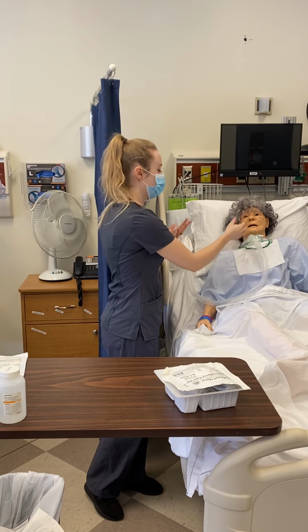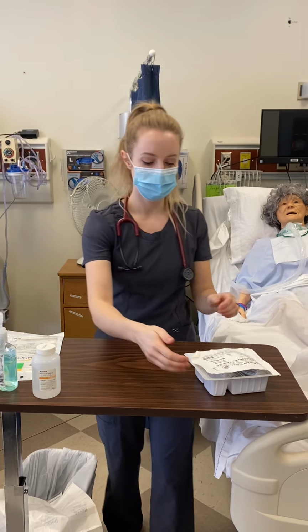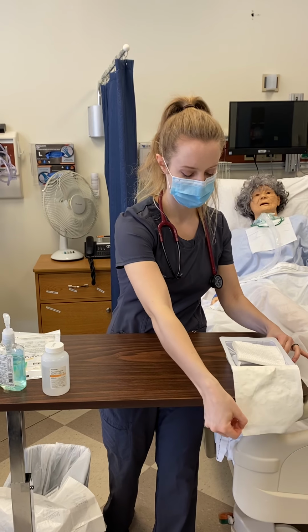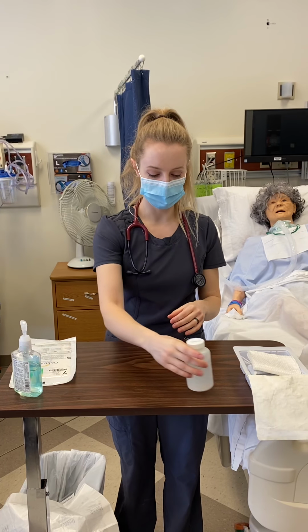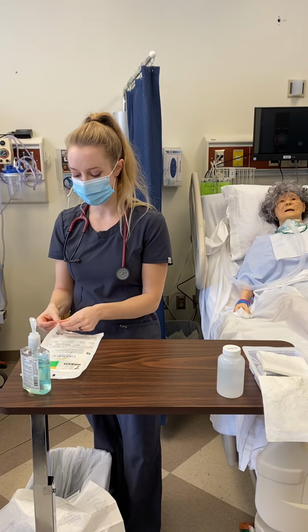My patient has been hyperoxygenated, and I will now open my tracheostomy care kit away from me. And I've performed hand hygiene. I have my normal saline, and I will now don sterile gloves.